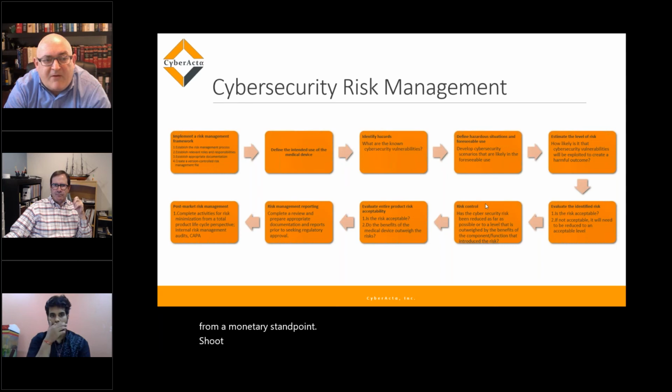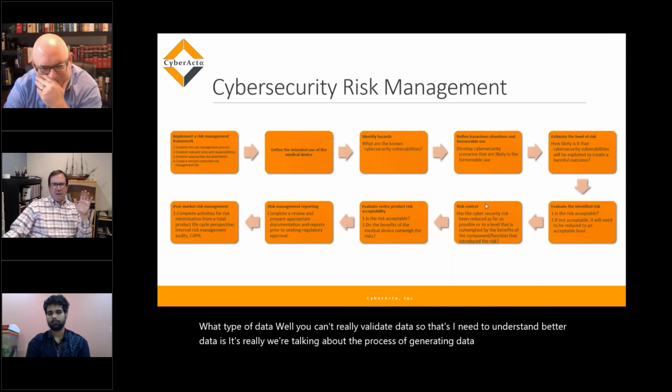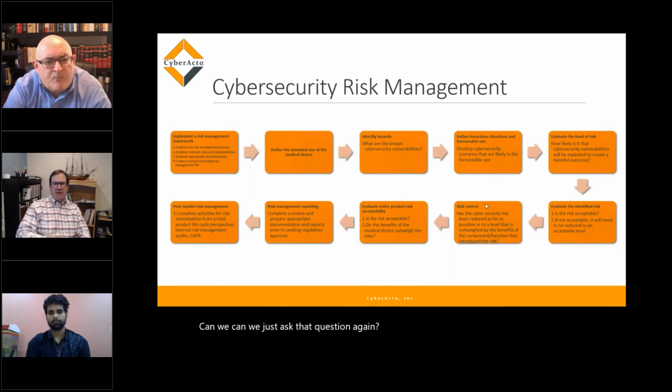What type of data? Well, you can't really validate data. I need to understand better. Data is really, we're talking about the process of generating data. I'm wondering, John, let's try this. I'm wondering if they mean the integrity of what's being stored there, not the data itself, just as you might have to validate an Excel spreadsheet, let's say, but to validate storage of information in the cloud. Might that be a fair interpretation?